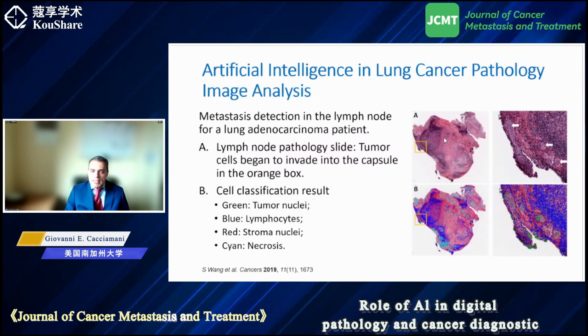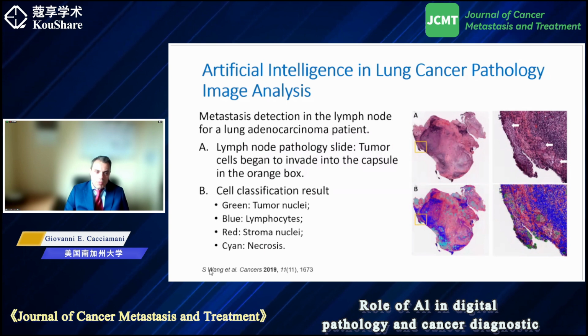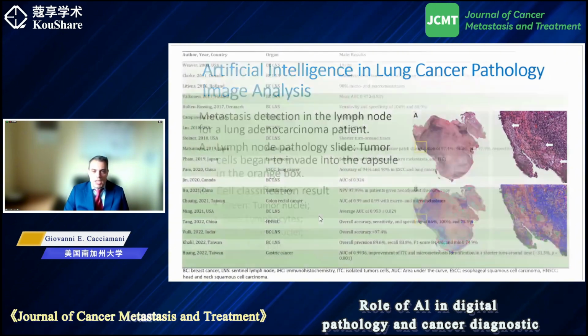Of course, we know that detection of micrometastasis is quite relevant because it changes quite dramatically the prognosis for our patients. And here you can see the cells that are highlighted, what's visible under the microscope could be analyzed and detected. Here you see the green dot in the digital setting. And indeed, in this relatively recent study, it was demonstrated that digital recognition of metastatic cells in lymph nodes is feasible with high accuracy. However, no proper comparison with humans alone was made, so we cannot consider it yet a phase 3 diagnostic accuracy study.